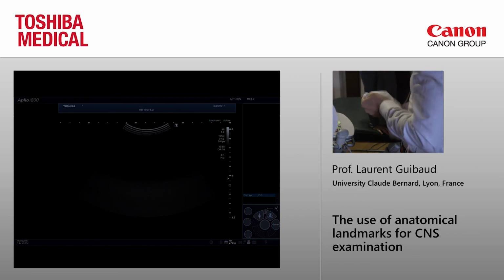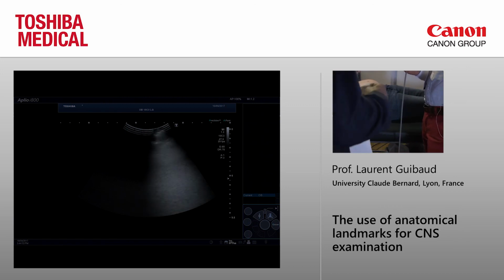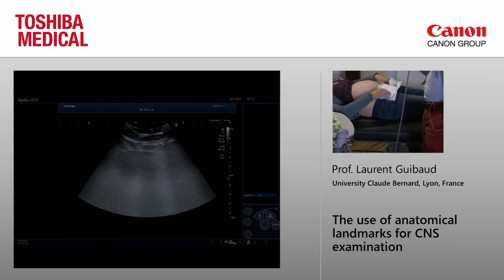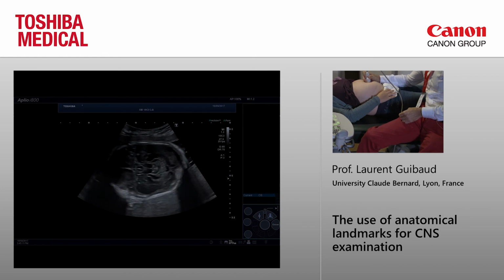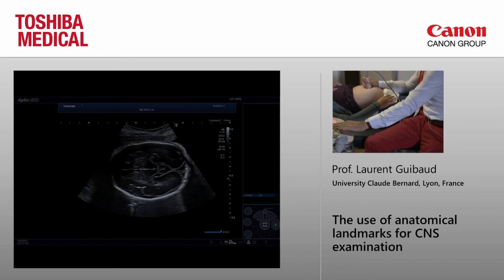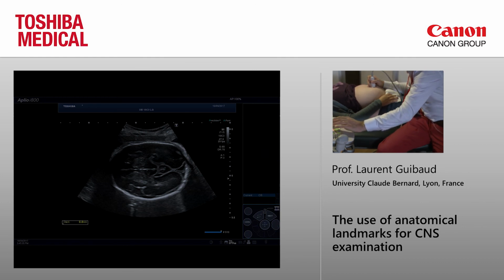Okay, you see, it can be tricky. It's here, this one.